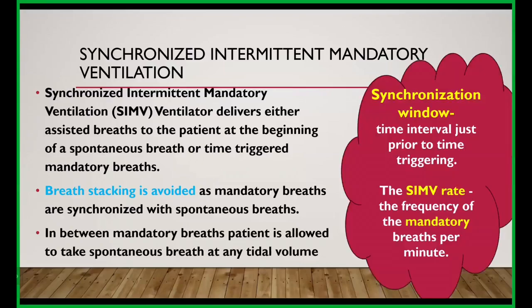So, what is the synchronization window? It is just a time interval just prior to the time triggering. Where does time triggering take place? It is just before the mandatory breath. This is called the synchronization window. When there is an effort in such a period, it will be turned into a mandatory breath. That is the importance of the synchronization window.